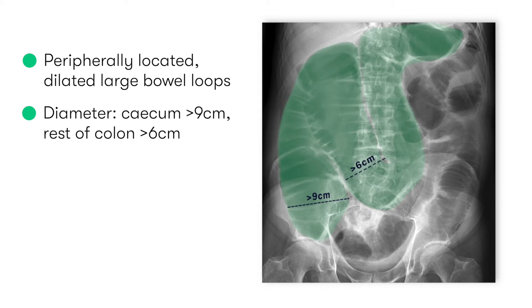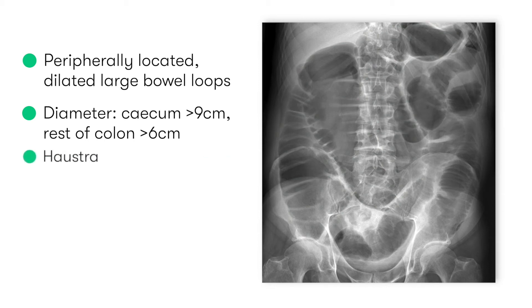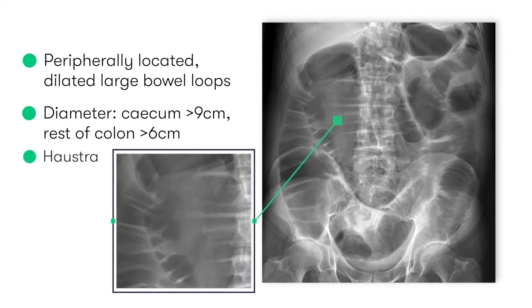We can tell that these dilated loops are large bowel rather than small bowel due to the presence of haustra. Haustra are saccular folds of mucosa within the large bowel which give it its characteristic segmented or pouch-like appearance, and you can see the haustra highlighted here.